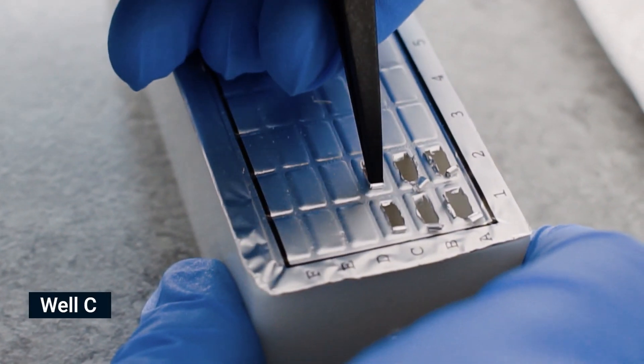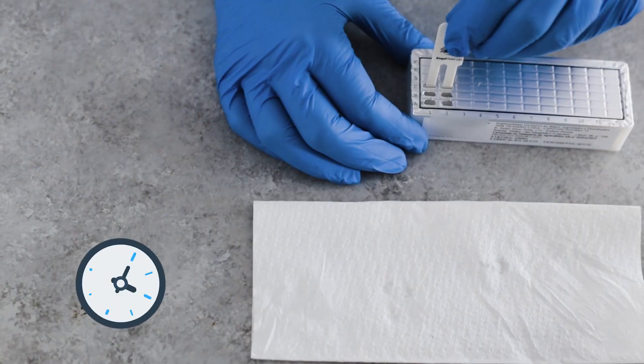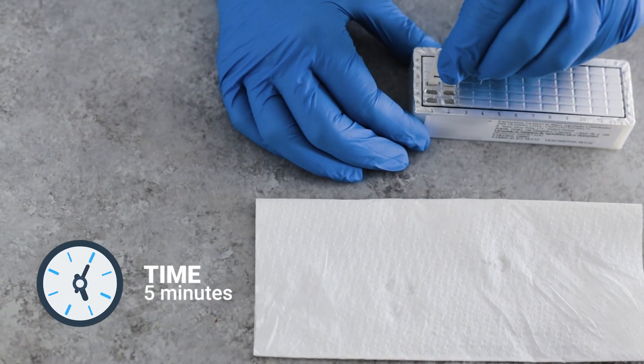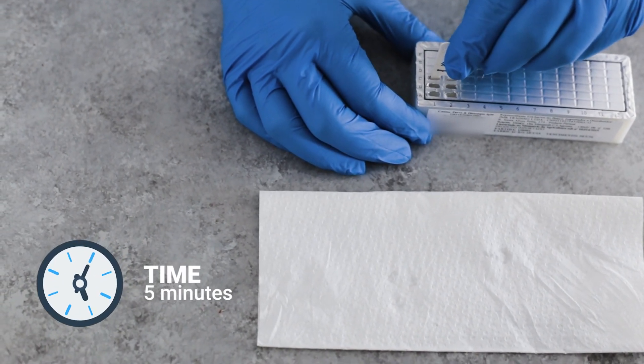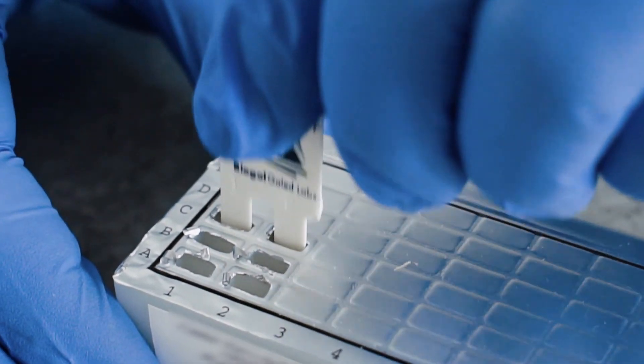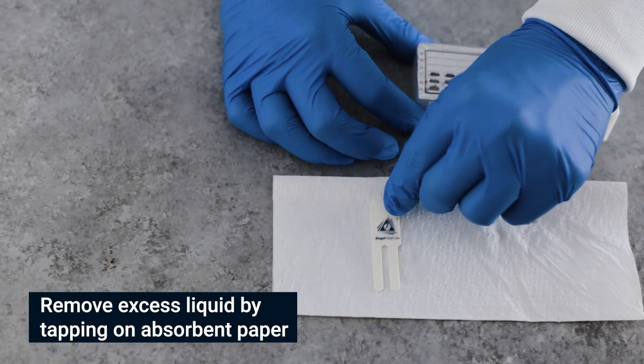Pierce the foil of the next wells in row C. Shake off excess liquid and insert the comb for 5 minutes. Move the teeth at least twice during this step, then remove excess liquid.